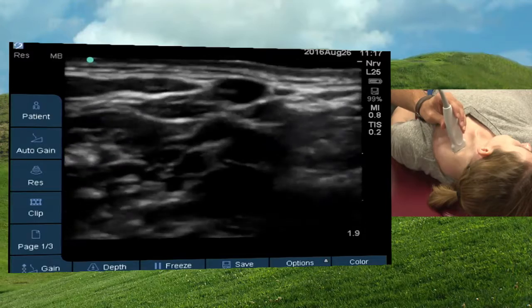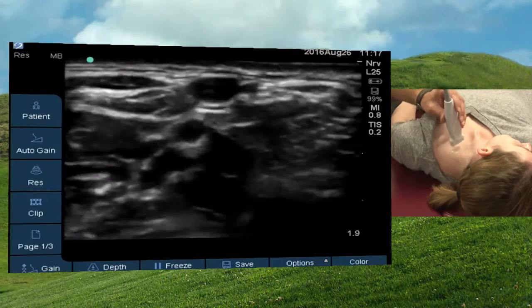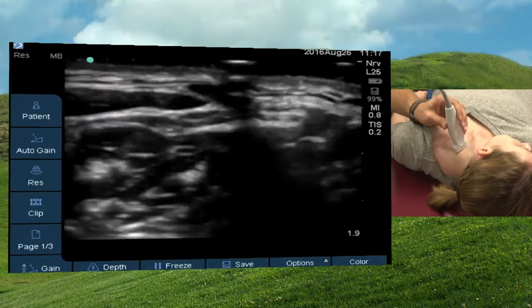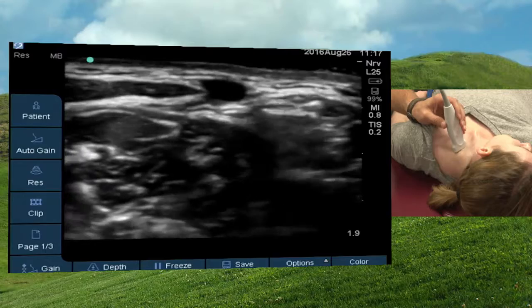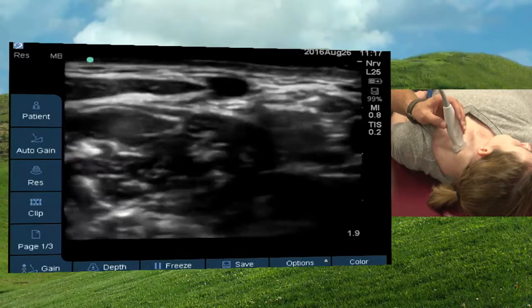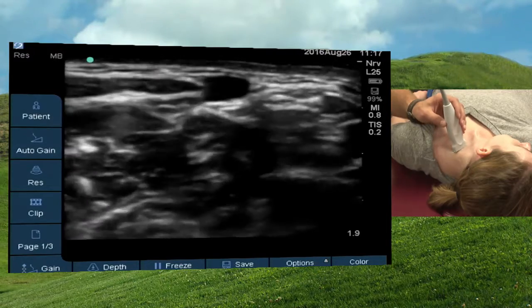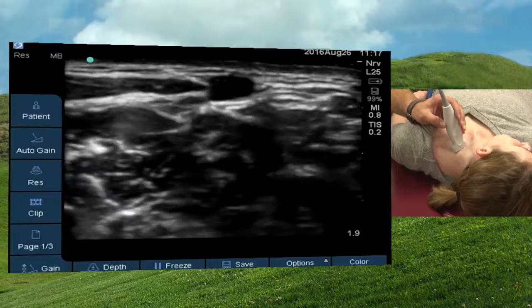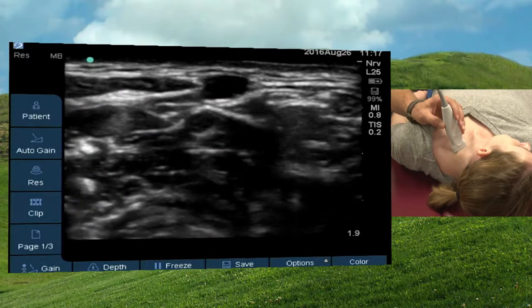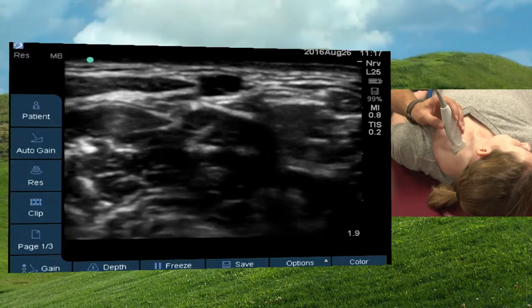The external jugular vein is a great vein to access on older people, okay? And that's because their saphenous veins have long been destroyed and ravaged by diabetes and venous insufficiency disease, but their external jugular veins tend to get really large because of things like heart failure and hypertension. Some of these are so big, you can literally put big old triple lumen catheters in them, like true story.